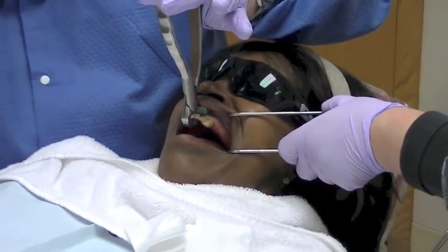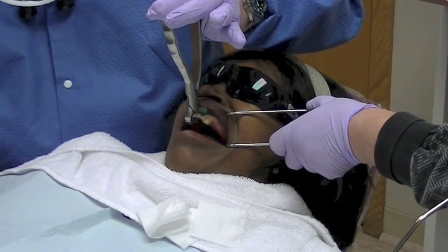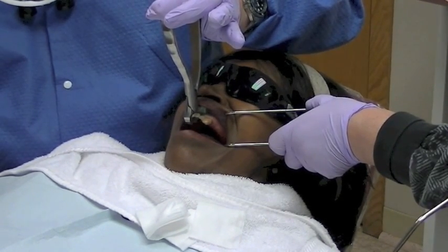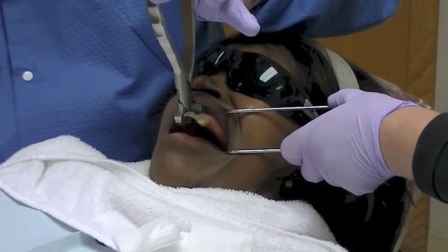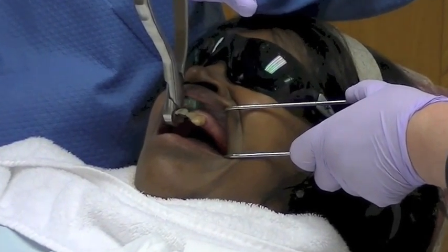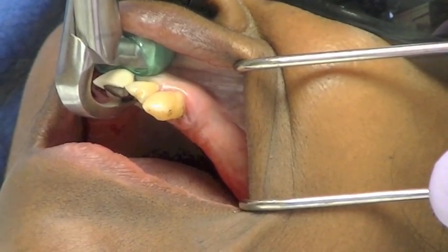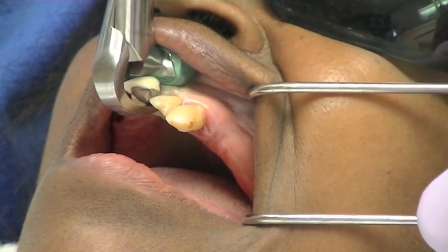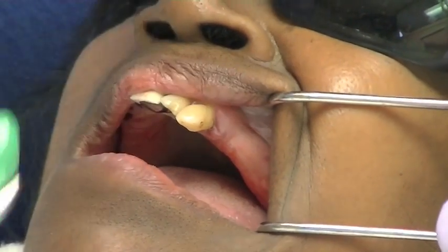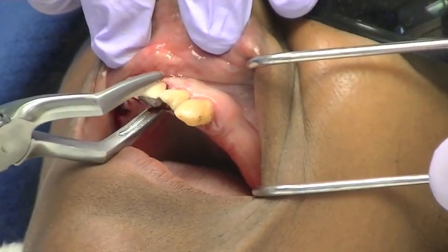The physics forceps operate as a dental elevator rather than a forcep, as the name implies. It uses first-class lever mechanics. One handle is connected to the bumper, which acts as the fulcrum. The other handle is connected to the beak, which is positioned most often on the lingual or palatal root of the tooth into the gingival sulcus. The bumper is positioned most often on the facial aspect at the mucogingival junction.